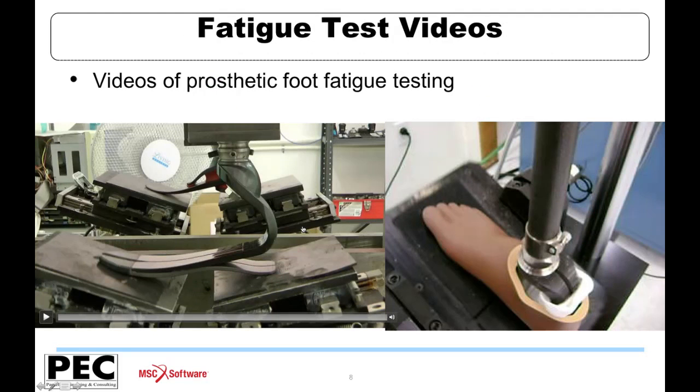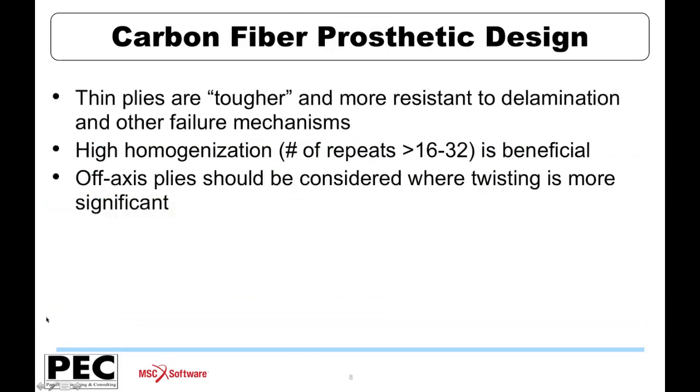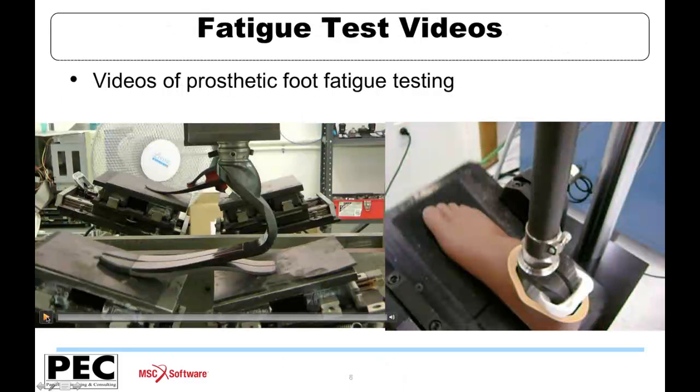And you see here on the right one of the foot forms around. On the left is a more open prosthetic. And these are both parts of a fatigue test system, two different types of fatigue test systems. So I'm going to run these as videos just to give you a little more sense of some of the ways that fatigue testing can be accomplished. Pardon me, let me go back there.